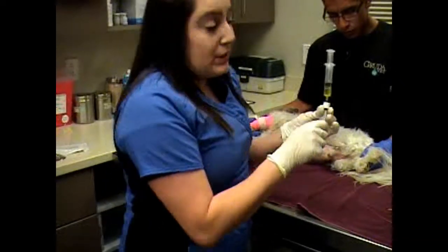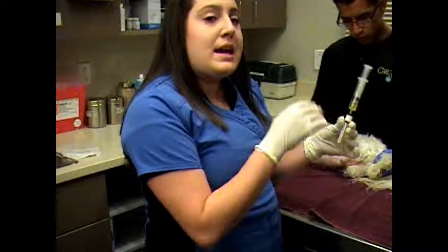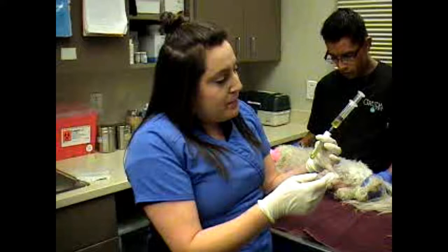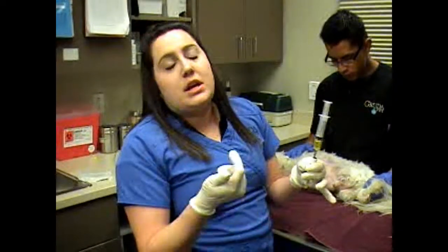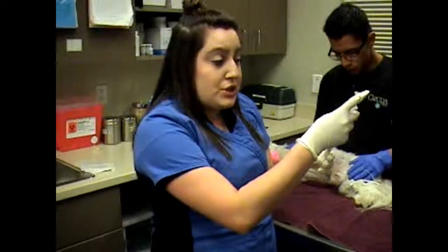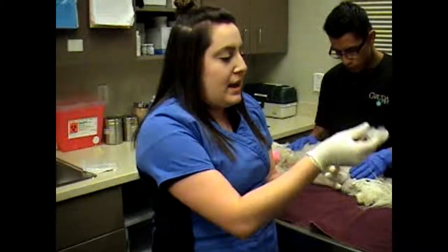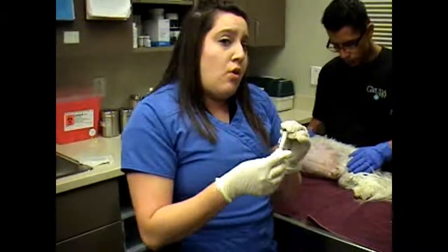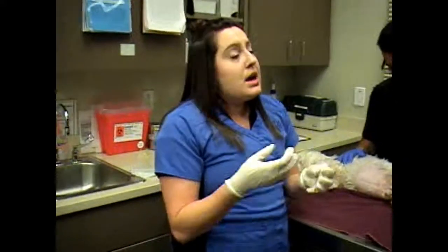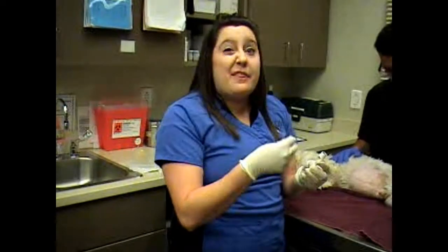What we'll do is we'll label this with the patient's first and last name, the date, and we can run an in-house urinary sediment with this, get a USG, we can do a urinalysis in-house, but if we aren't going to be doing that within the next 30 minutes or so, we'll just go ahead and stick this in the fridge, or if we're going to be sending out to an outside reference lab, we'll stick it in the fridge, make sure that we don't leave it out at room temperature, because that can alter or cause crystals that weren't necessarily in the dog's bladder or in the urine to form in this.